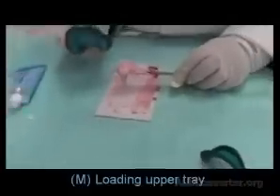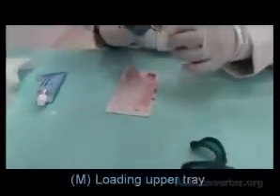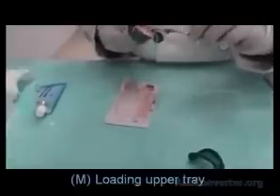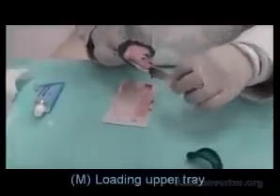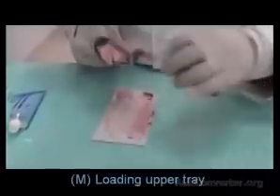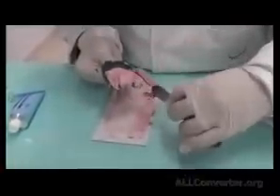For the upper tray, we're going to wipe the material over the surface. So we're going to spread it into the posterior parts, middle parts. We have to make sure that the material flows around the sulcus. So we want to make sure that the material flows on all sides.